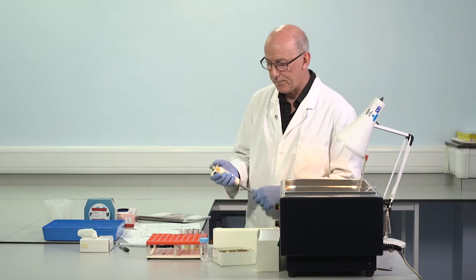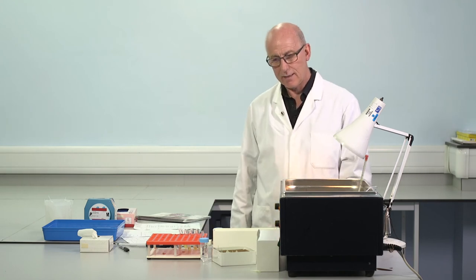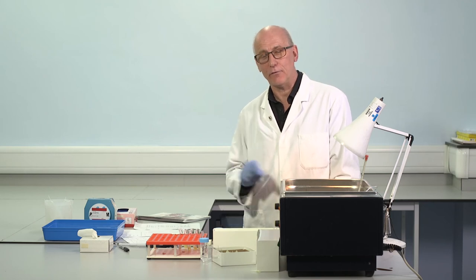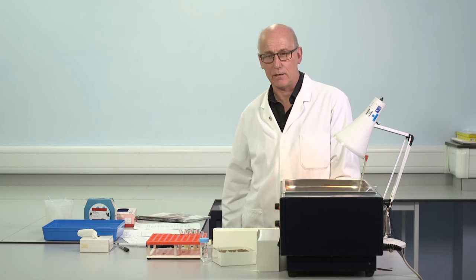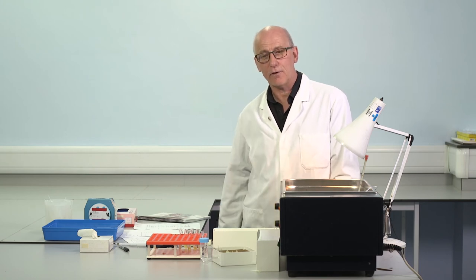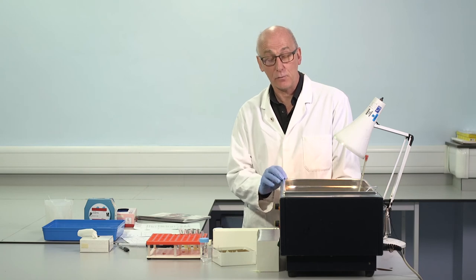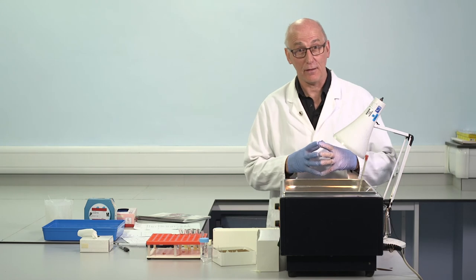This is a different reagent. It contains a significantly higher phospholipid concentration. It's not the only difference between these two reagents. The activator is ellagic acid, the previous one silica. The biggest difference is in the phospholipid concentration. In this second reagent, the concentration is around 15 to 20 times higher than in the first reagent.